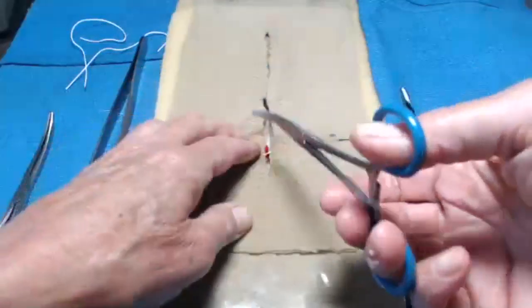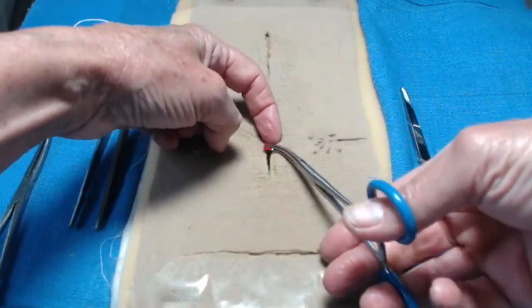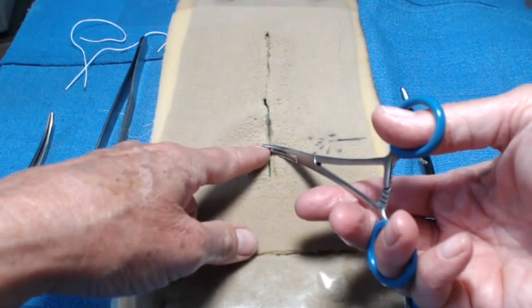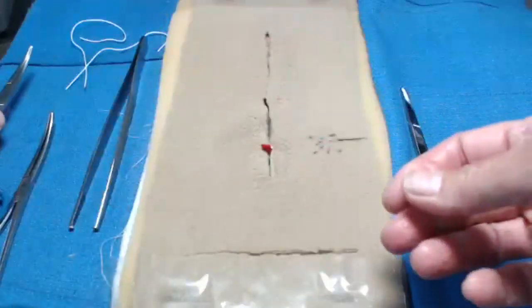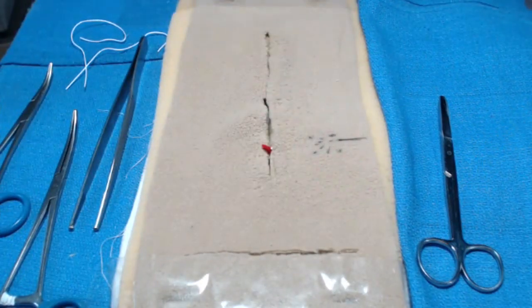It's very helpful to have somebody else actually holding the clamp. Then as you tighten your knot, they can either flash or release the clamp so it's not in your way as you do your subsequent ties. If you have questions, please post them in the comments and feel free to reach out by email to midwifeworkshops at gmail.com. Thank you.